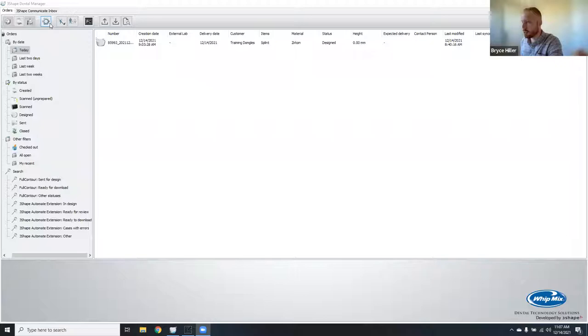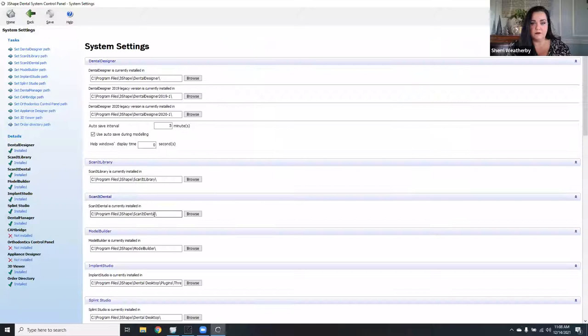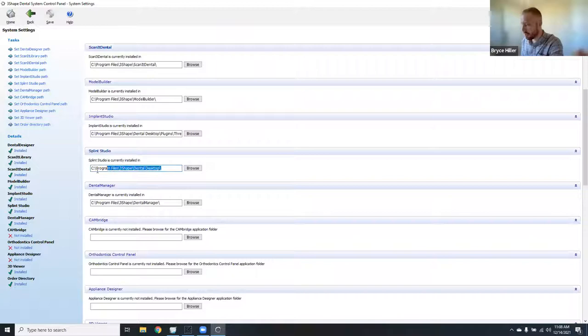In the Splint Studio installation file path setting, type in: C:\Program Files\3Shape\Dental Desktop. That will allow you to order your splint in Dental System, and when you click the design button, it'll jump you over to the Splint Studio module. If you don't do this, you have to order it in Dental Desktop — it's just a quality-of-life improvement.